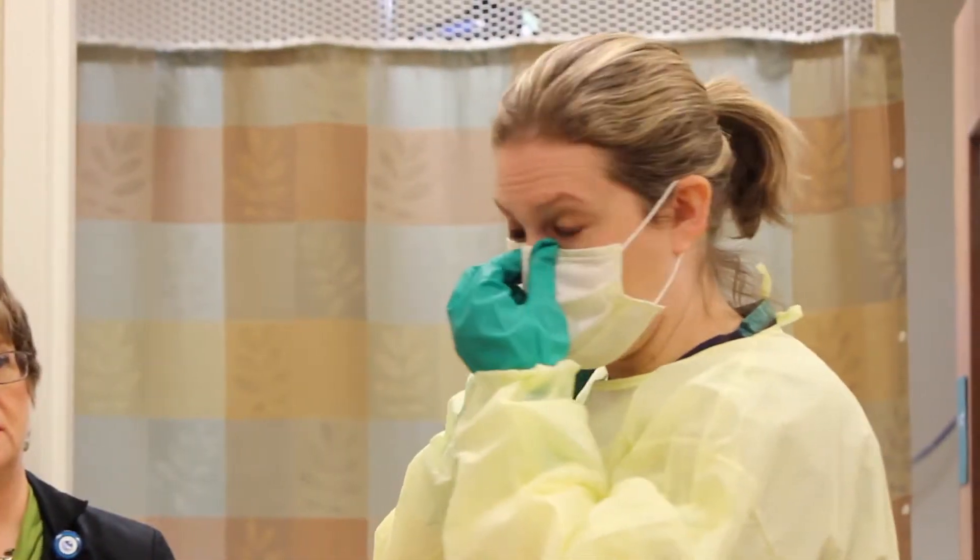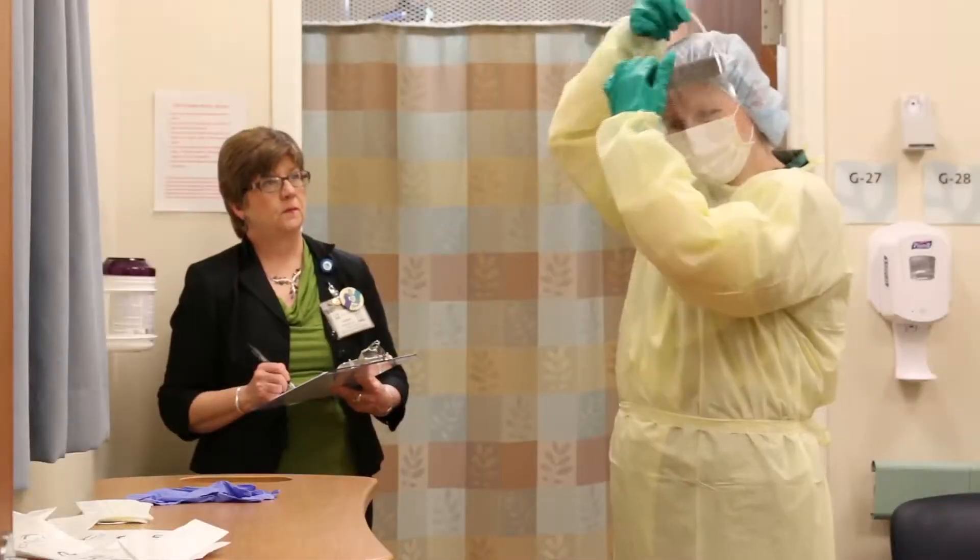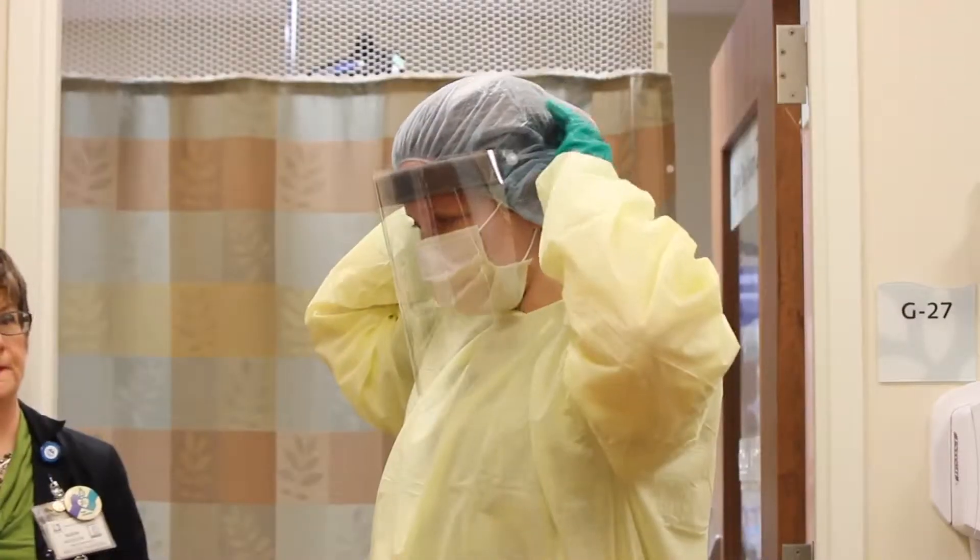Then, put on the procedure mask and don the head cover or hairnet. Put on the full face shield and adjust it for comfort.